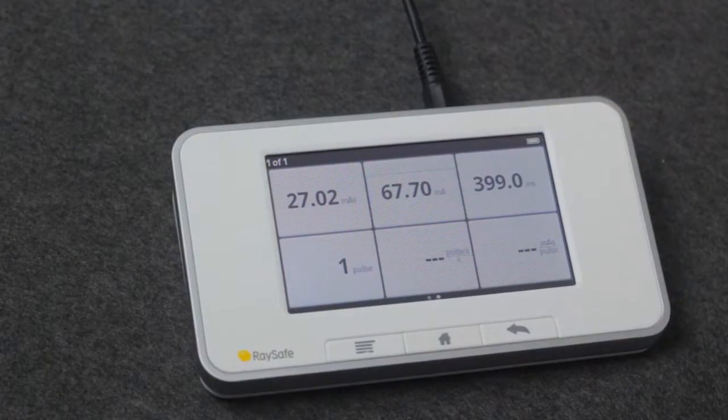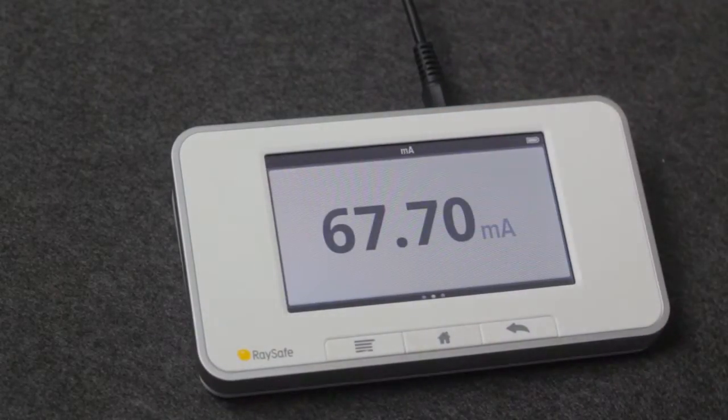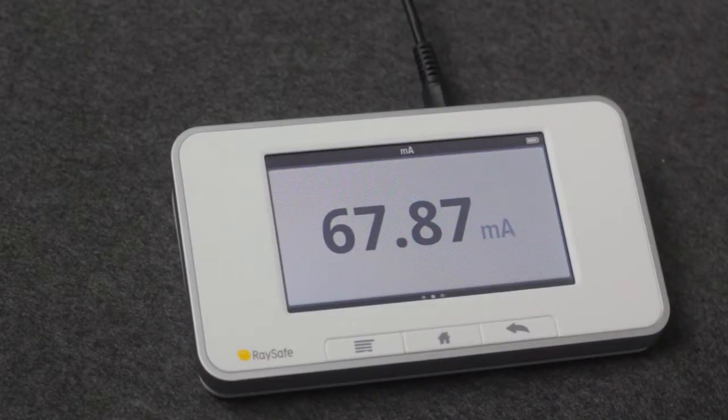To see one parameter in big view, touch this parameter. When you make a new exposure, it stays in this window.